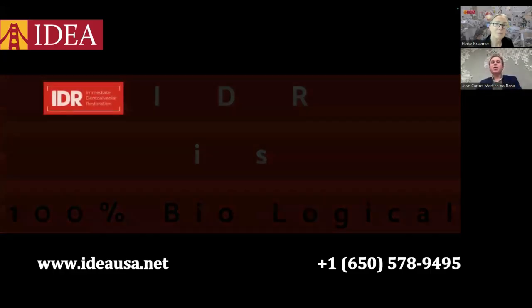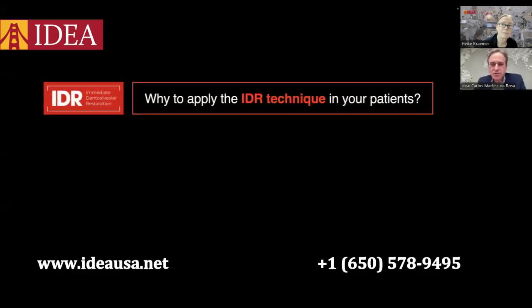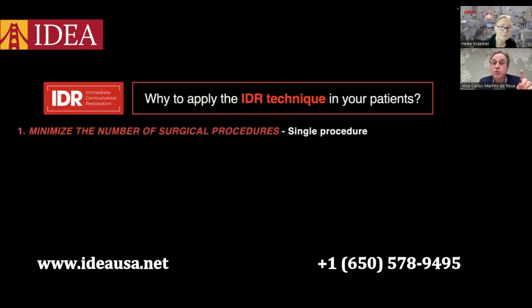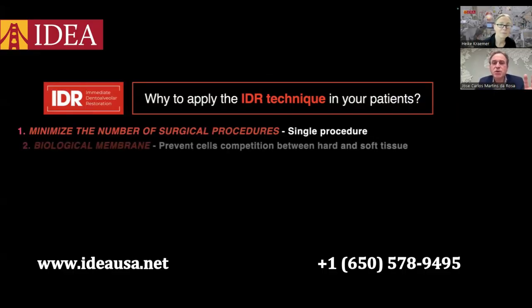So why apply the IDR technique in your patients? For many reasons. Let's focus on them one by one very quickly. First of all, to minimize the number of surgical procedures, because it's a single procedure. Number 2, we can use this graft as a biological membrane to prevent cell competition between hard and soft tissue.